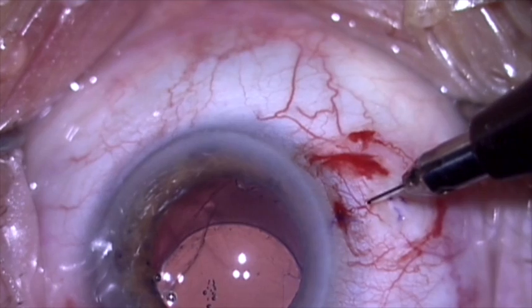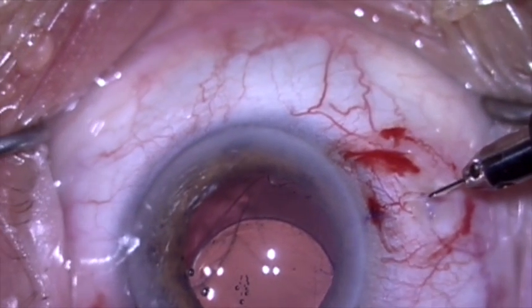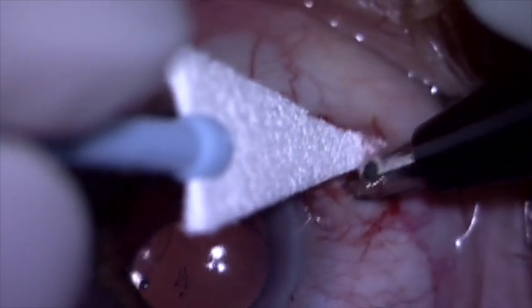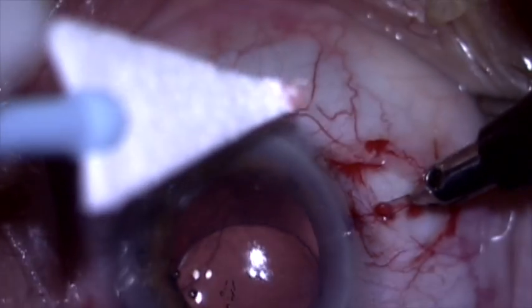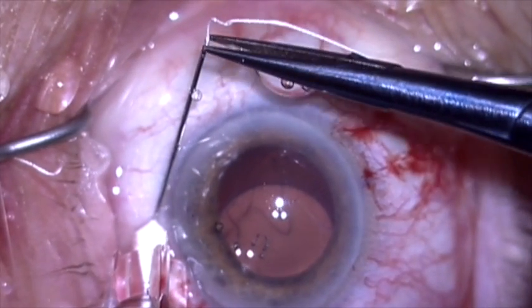Now we're going to make a radial groove with a diamond blade. This groove starts at about one and a half to two millimeters posterior to the limbus and goes back about three and a half millimeters posterior to the limbus. I'm going to puncture this with my diamond blade to create two sclerotomies at the top and bottom of the groove.